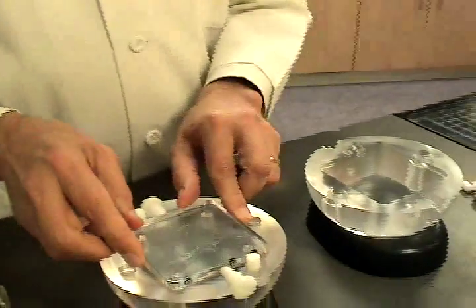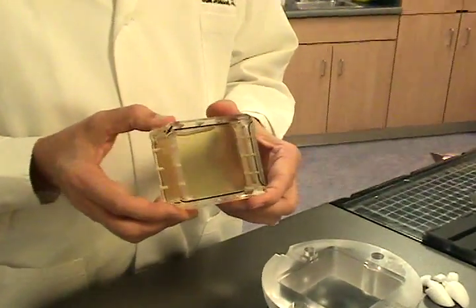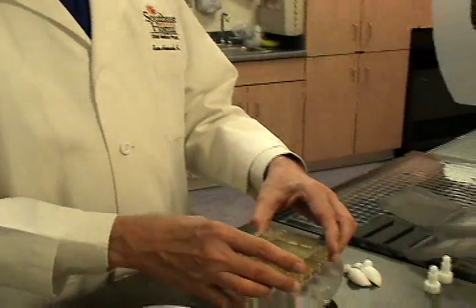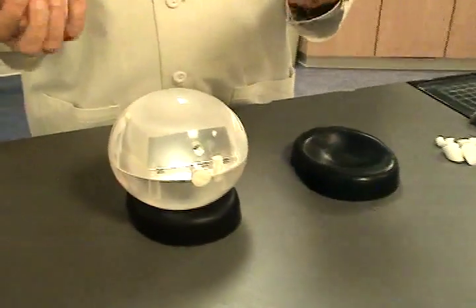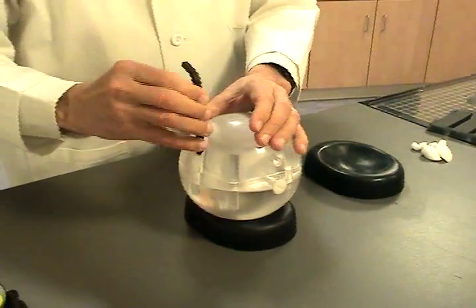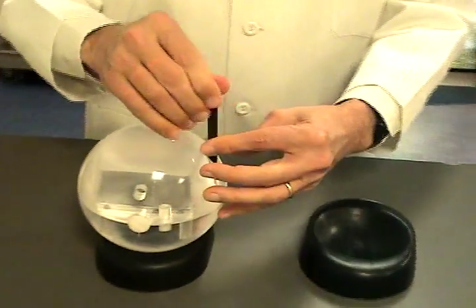That goes into this side of the phantom. You also need your signal generator — this is what generates the signal for the MRI scan — and this goes into this side. You assemble the phantom by putting the two hemispheres together. There are the two Allen screws that hold them together. Tighten those with your Allen wrench. All these tools do come along with the phantom.